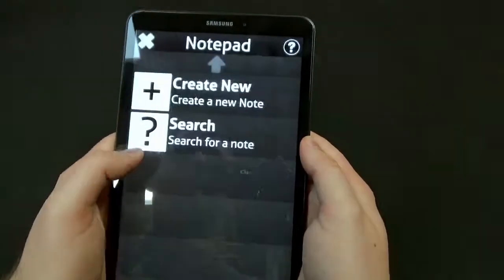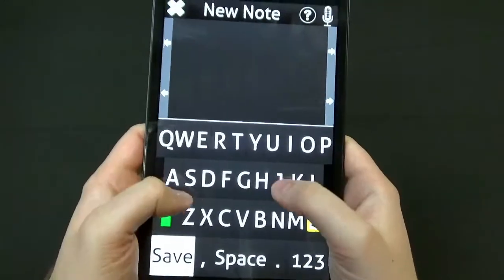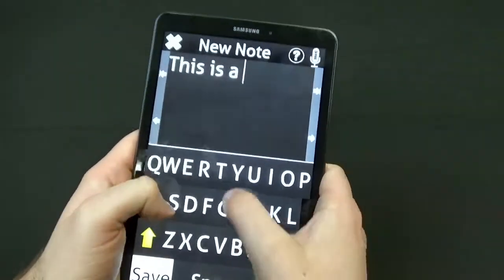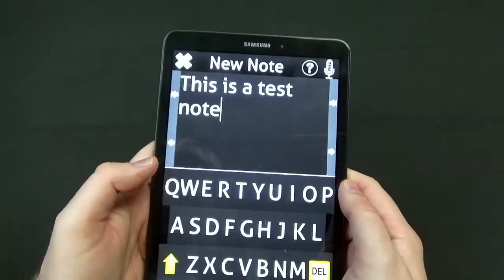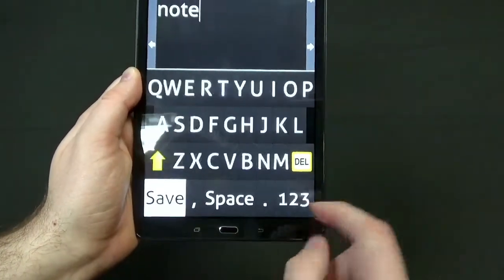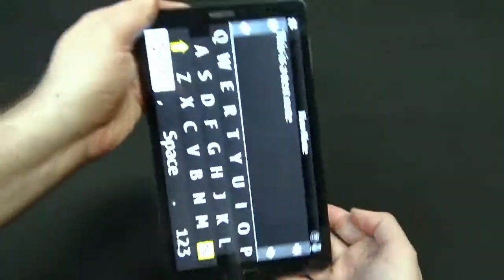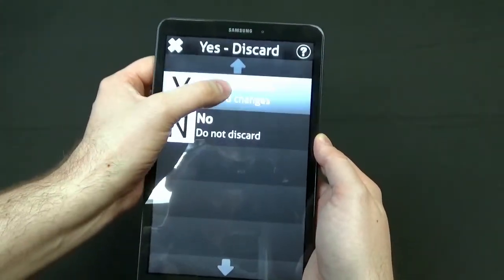Let's take a look at typing a note so you can see what that looks like. Creating a new note gives you a nice big onscreen keyboard to type with, and it works really nicely. You can type really fast — it's big and high contrast. You can switch over to numbers, and you can switch into landscape mode too, which makes the keyboard a little larger and a little easier to use. You can save that note or exit.